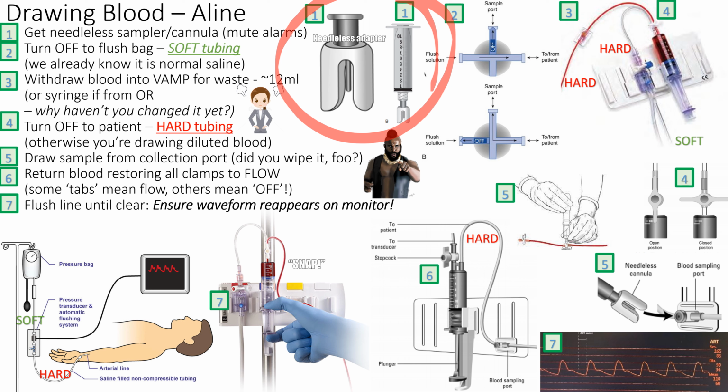So if you look, there's a syringe, it's actually the balloon syringe, but any syringe that's luer-locked will do, right? Even a non-luer-locked one, like an A-line or arterial blood gas sampling tubing or syringe, can also work. With this little adapter we're going to grab, stocked for us, it's a needleless adapter because we can't be trusted with needles, right? Because we'll poke ourselves inevitably.